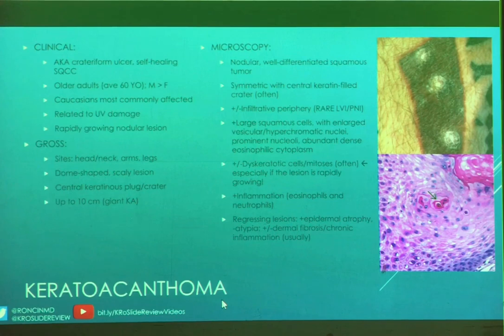They have this central keratinous plug or crater, and they can be up to 10 centimeters in size. And at that point, that's a giant keratoacanthoma. On microscopy, they're nodular, very well differentiated squamous tumors. Okay, because again, tumor just means proliferative growth. It doesn't necessarily mean malignant. They are symmetric with that central keratin-filled crater.